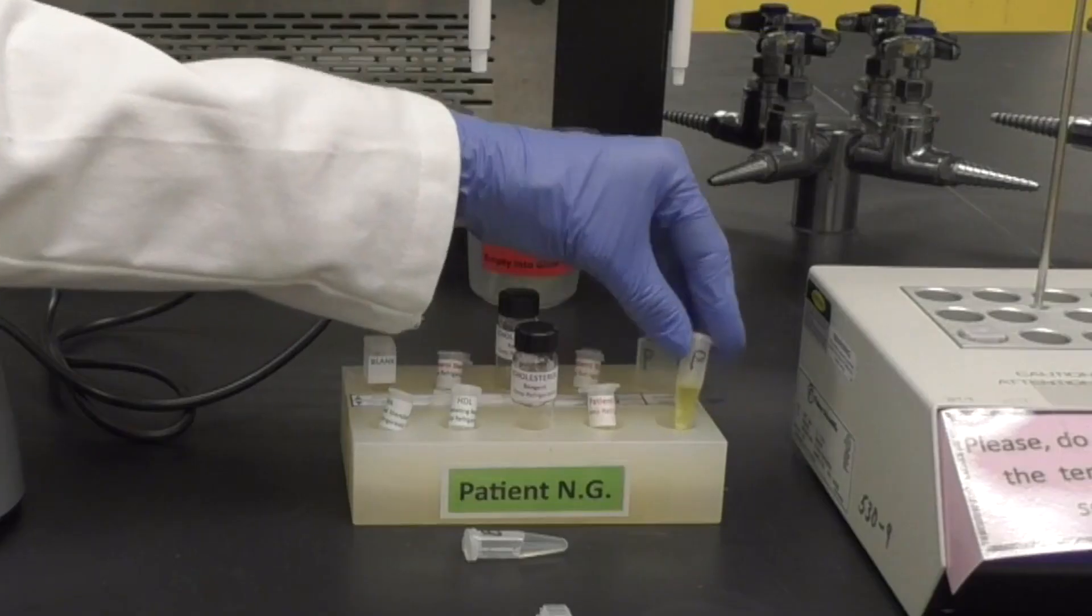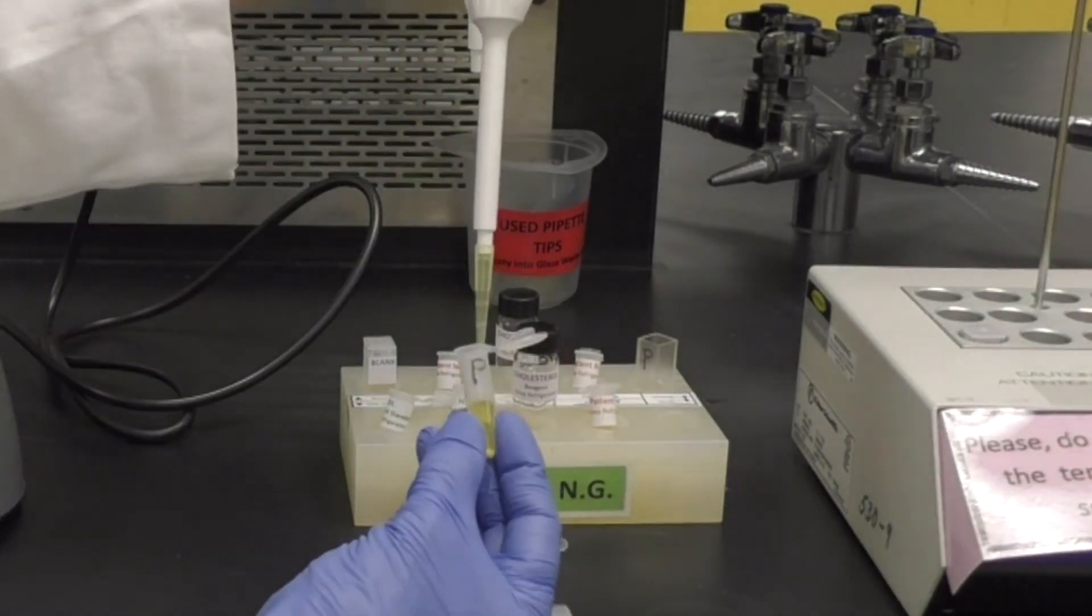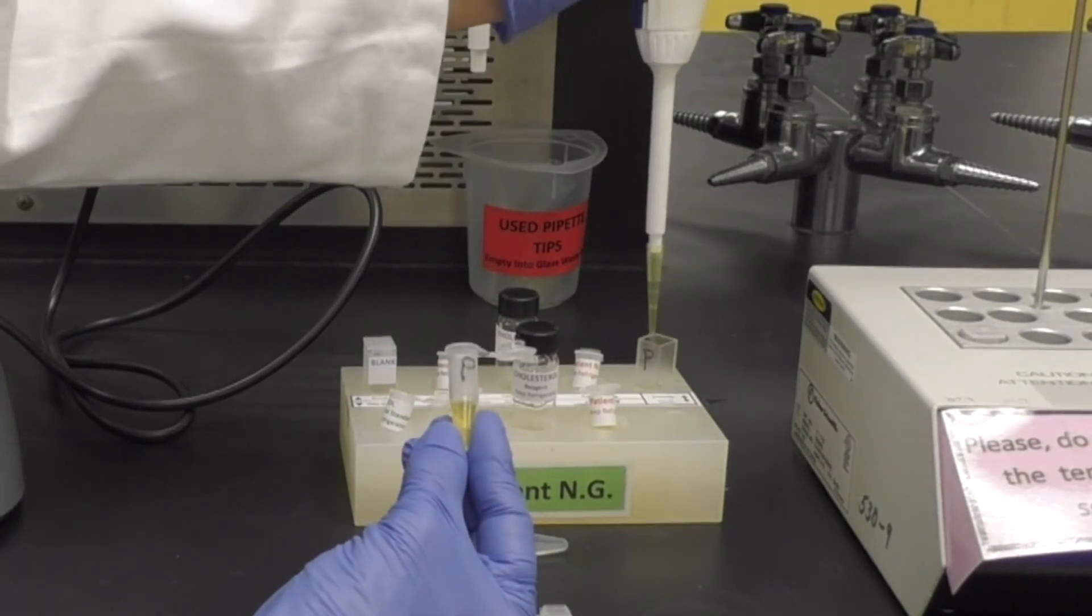After a couple of minutes, add 50 microliters of the light yellow liquid from the patient microfuge tube to the remaining cuvette. Mix and warm for 5 minutes.